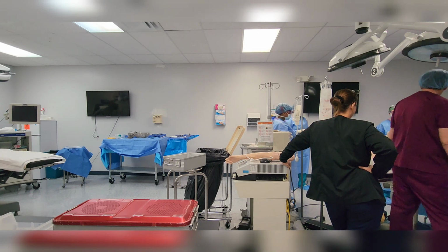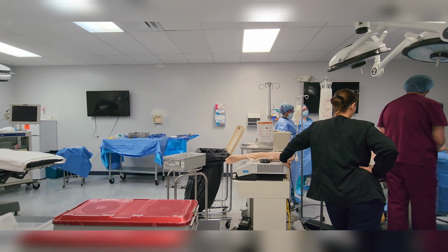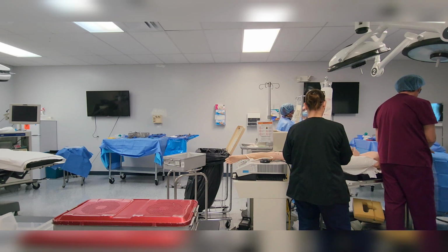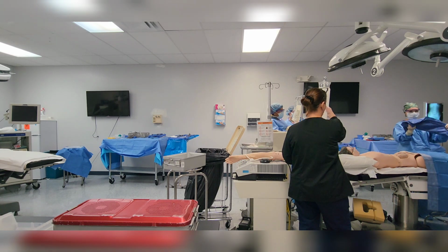If something is exposed and you can't move it, just put some blue towels on it. Just leave it alone. It's not good to move things around and go towards the incisional site. Just commit to that. If something is exposed, you've got blue towels. You're going to be squaring off this area anyways. You can always re-square off, recover something.